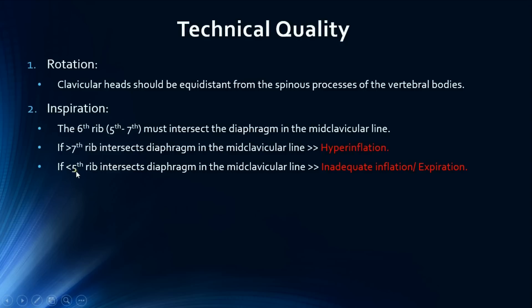If lower than the fifth rib is intersecting the diaphragm in the mid-clavicular line, this indicates inadequate inflation, or it could indicate that the chest radiograph was taken during expiration.